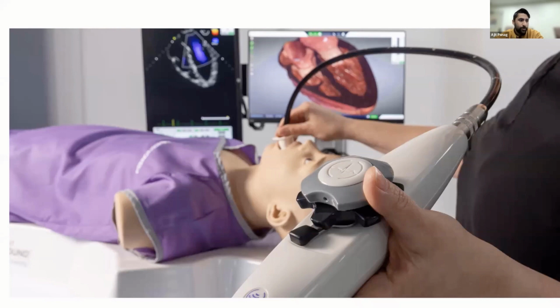Sophia talked about the Heartworks TEE model already, which is much higher fidelity. And in my opinion, the higher fidelity simulators are best used in cases where they don't happen every day, right? You don't do or see a TEE on every single ER shift. And so outside of really practicing this in the operating room, this is the best case scenario we have to get good at TEE.